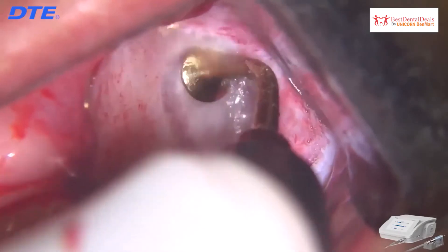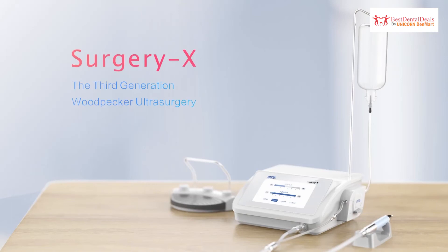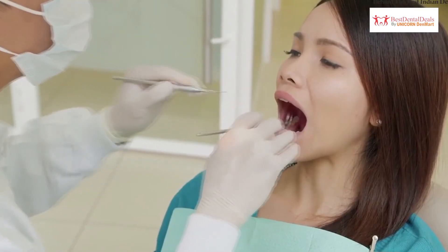Due to minimum bleeding owing to the cavitation effect, Surgery X is a highly advanced third-generation piezo surgery unit, providing a huge advantage not just to the doctors but to the patients as well.